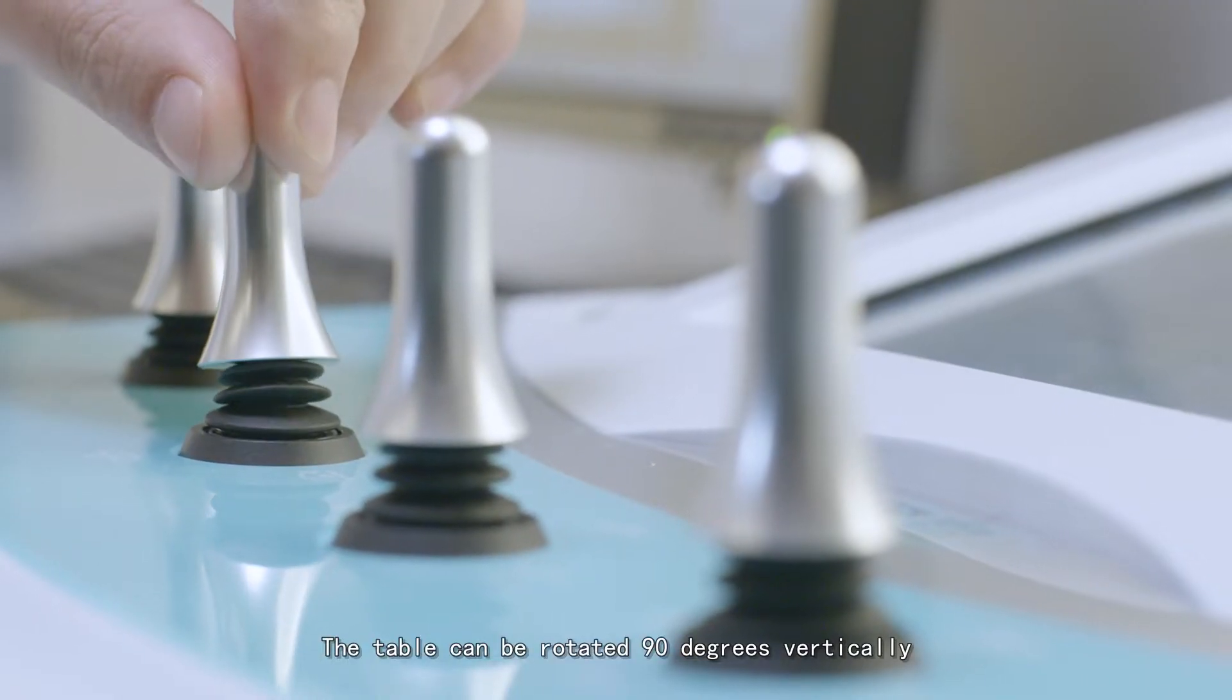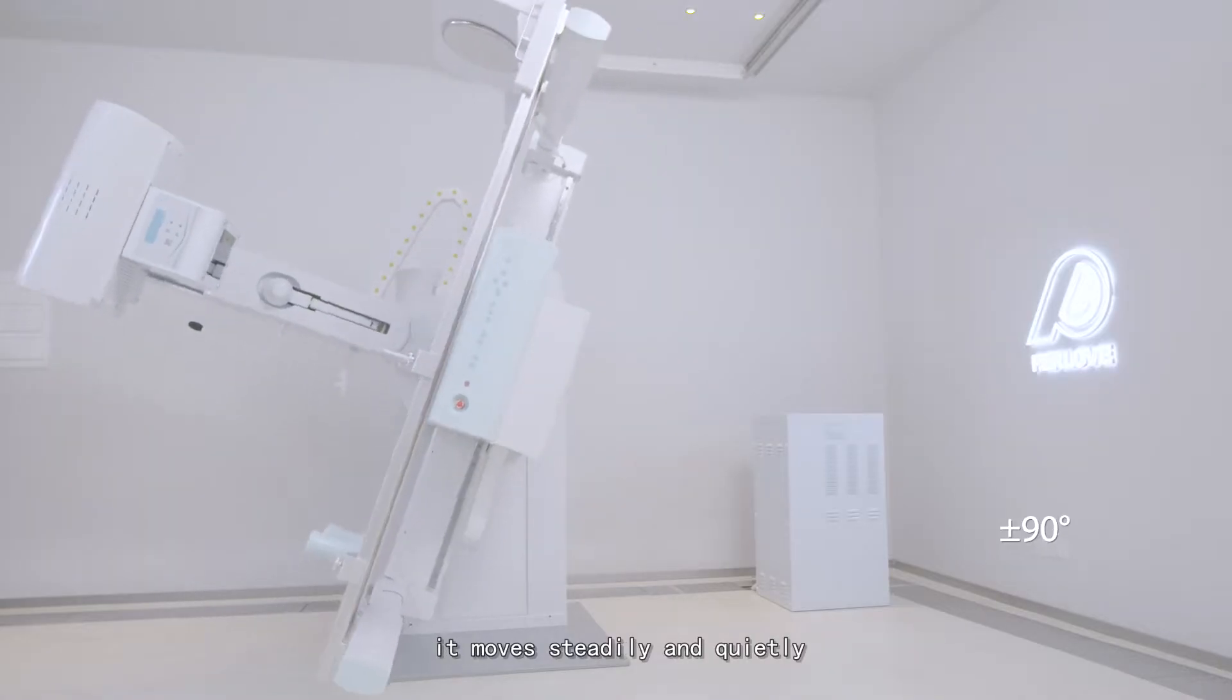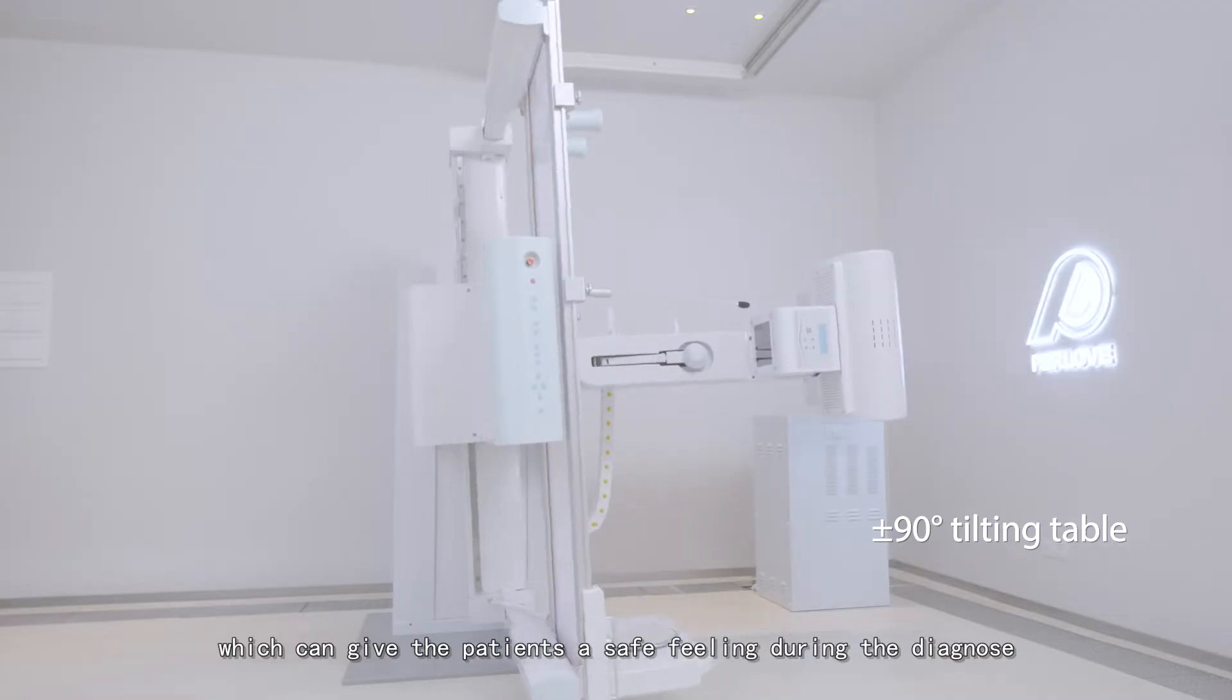The table can be rotated 90 degrees vertically, greatly extending clinical applications. It moves steadily and quietly, giving patients a safe feeling during diagnosis.